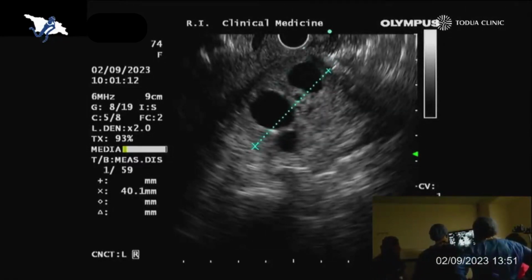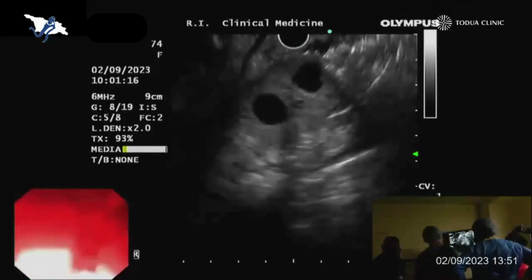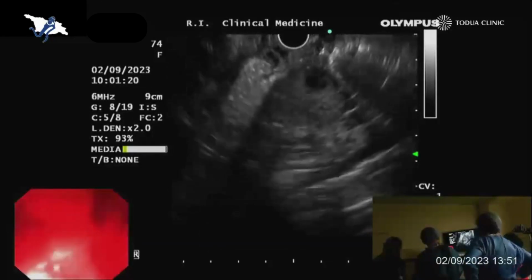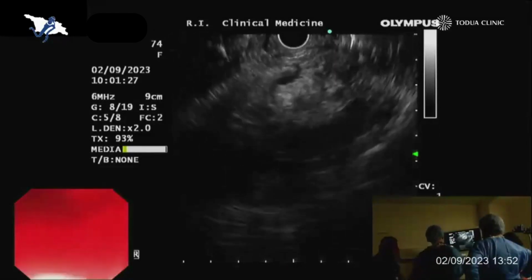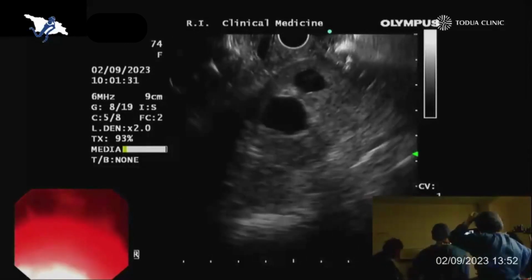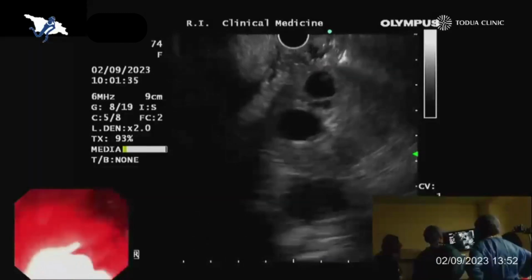I think the radiologist is in the room. Maybe you can ask him, Mamuka, how large for him was the lesion in the MRI. And we have now the problem with the EUS. We have not such a good overview. So the radiologist can tell us how large his impression was of the cystic lesion. So we had this upper part, which looked like typical IPMN.